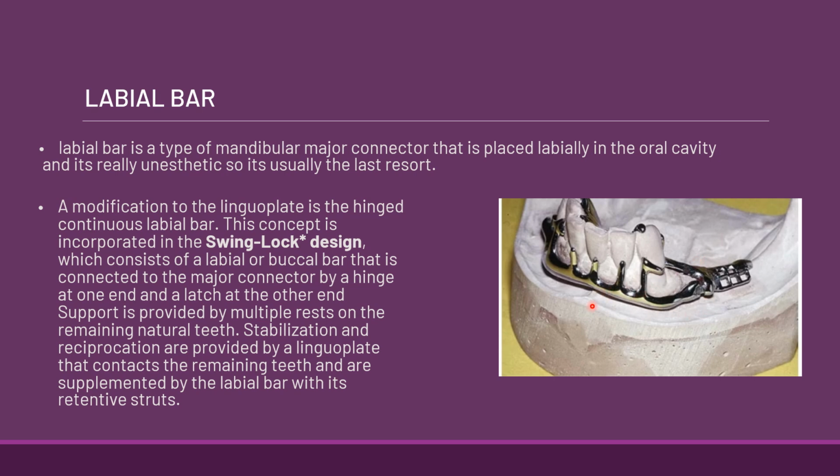Support is provided by your rest areas, just like in other major connectors. Stabilization and reciprocation are provided by your lingual plate.